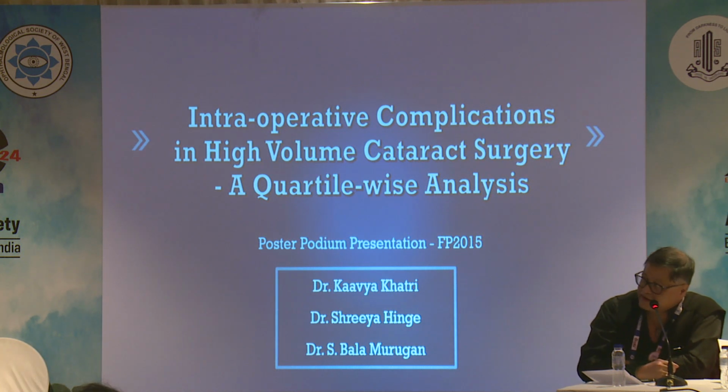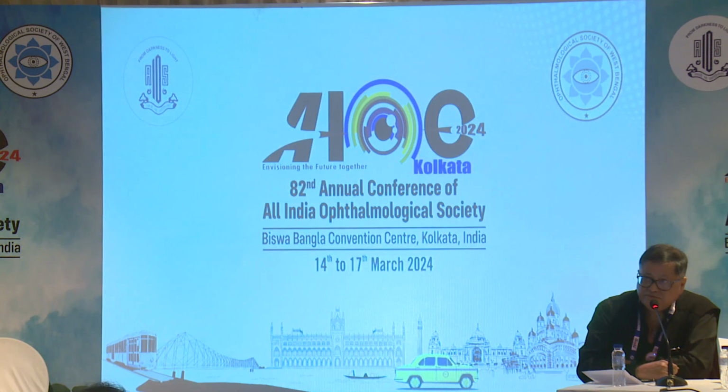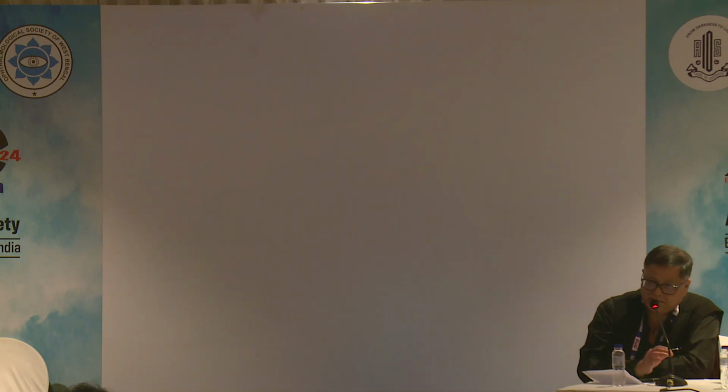It's not getting forward? Don't panic. It happens.